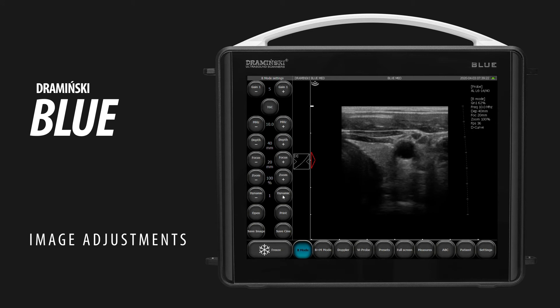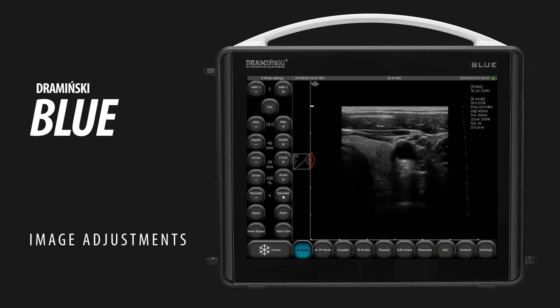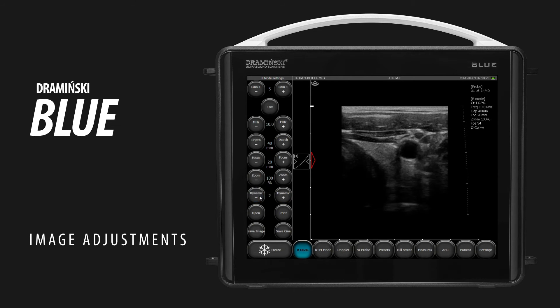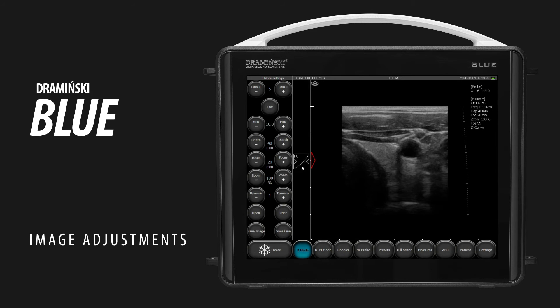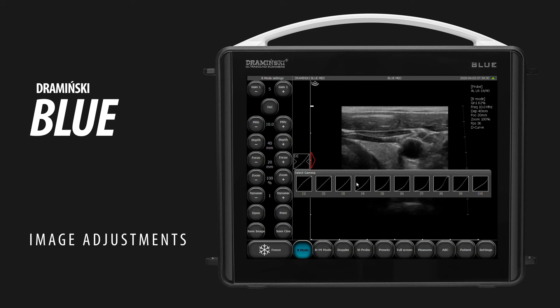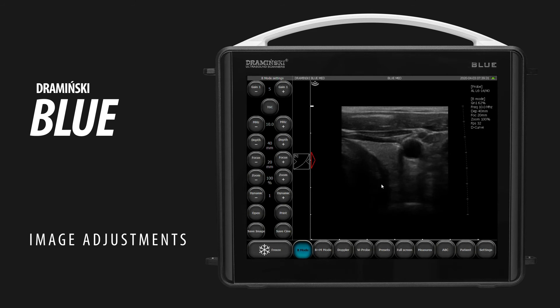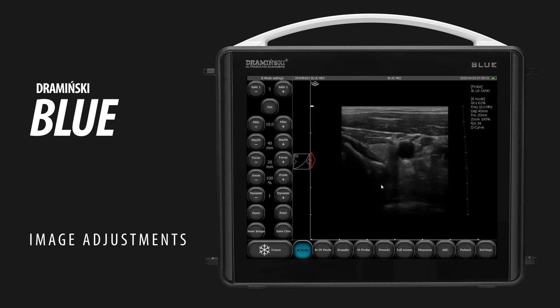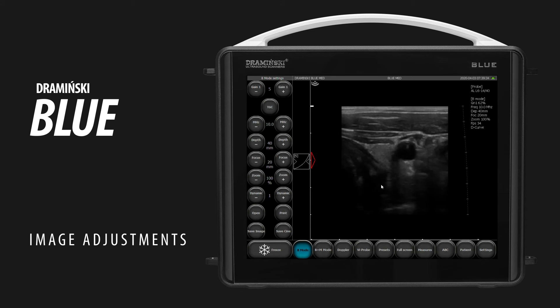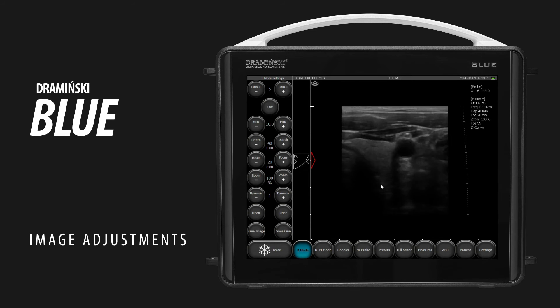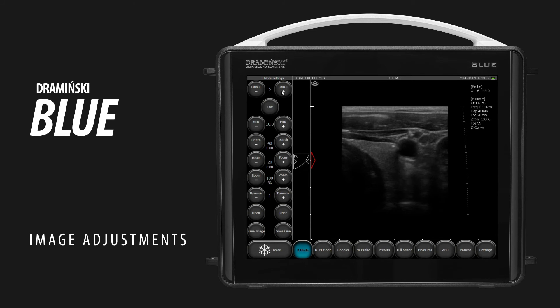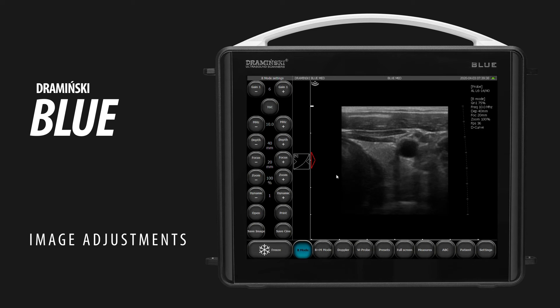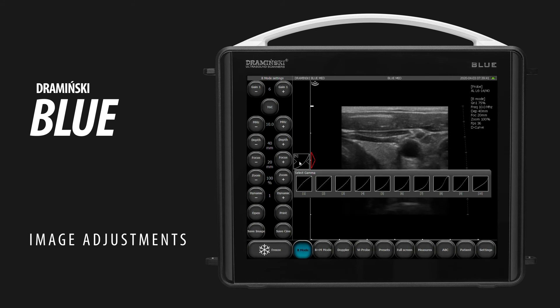To change contrast, use the dynamic buttons. To change the gray map, tap the gamma curve and choose one of the default settings. Remember that gain correction may be needed after contrast or gray map adjustments.